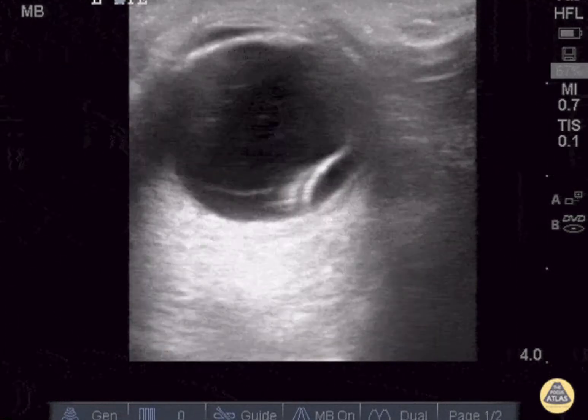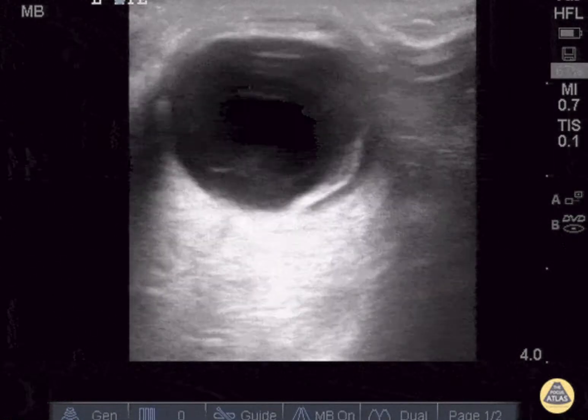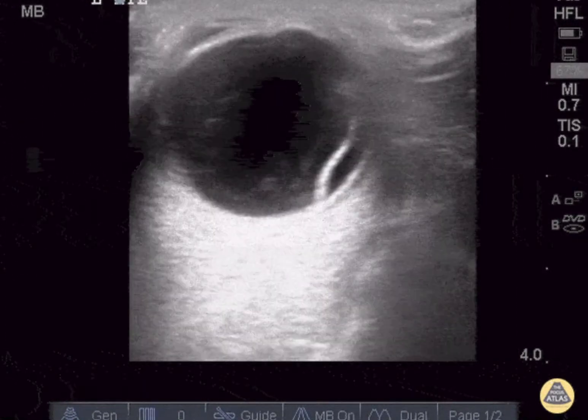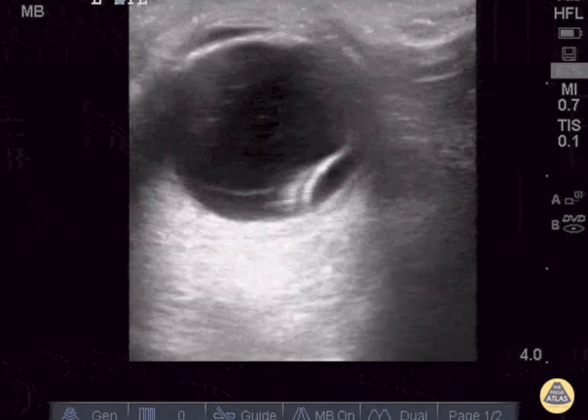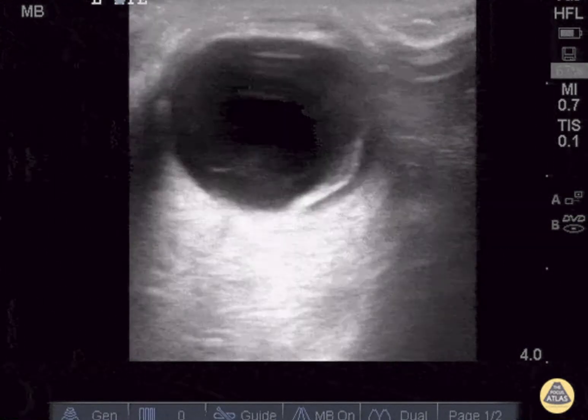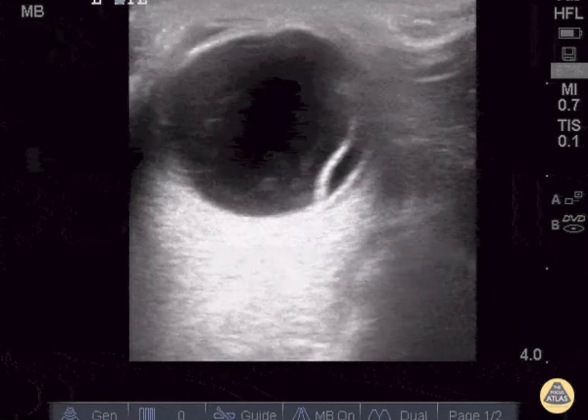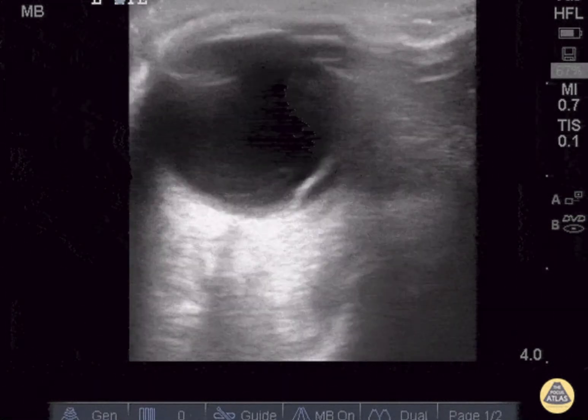This is an ocular ultrasound clip demonstrating a vitreous and retinal detachment. A linear transducer is used and placed in a transverse orientation on the upper eyelid.